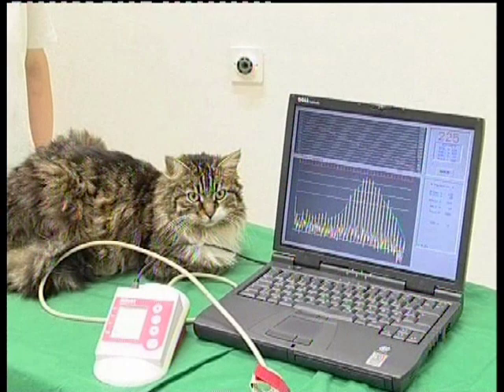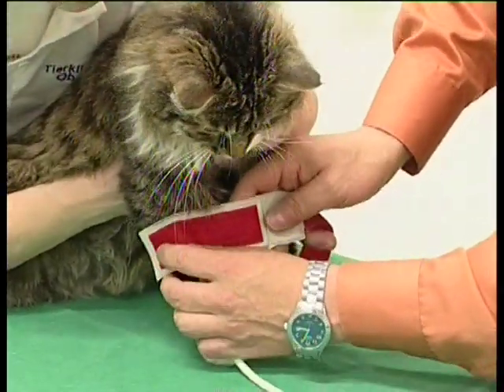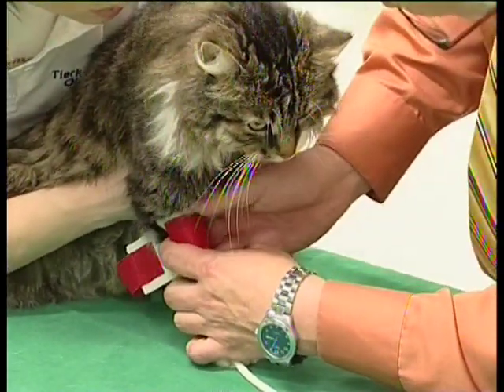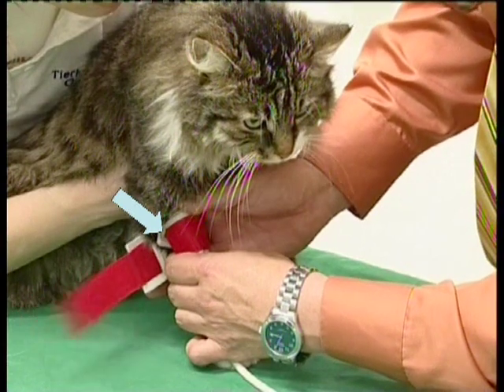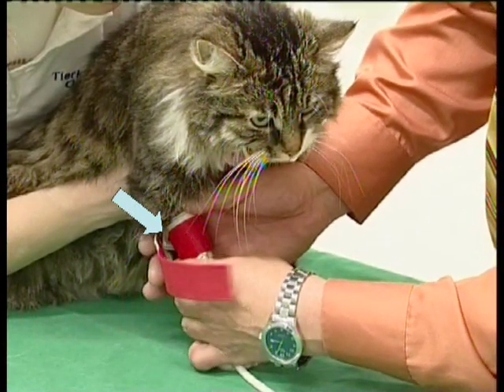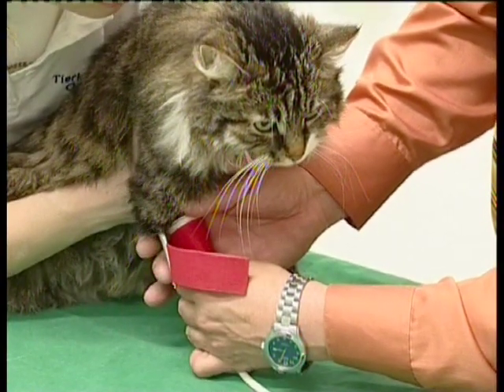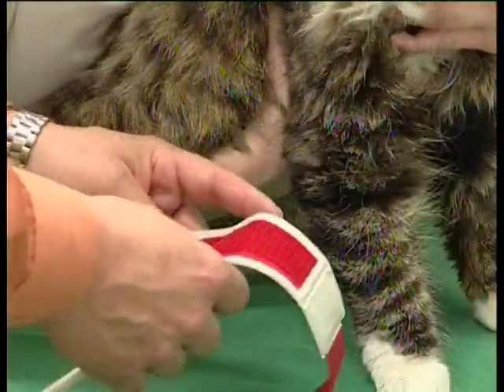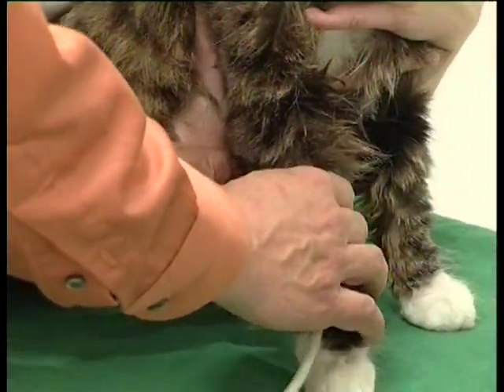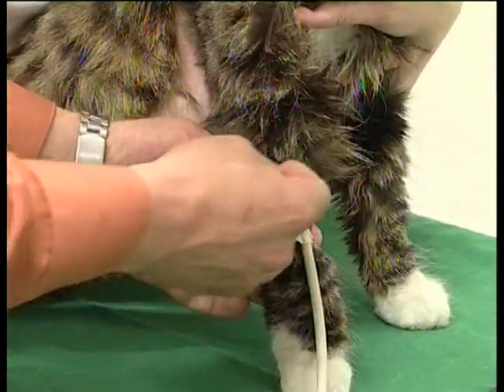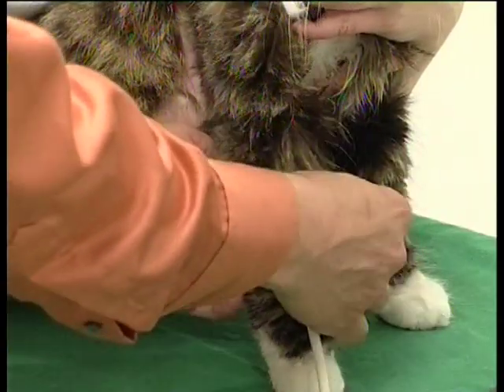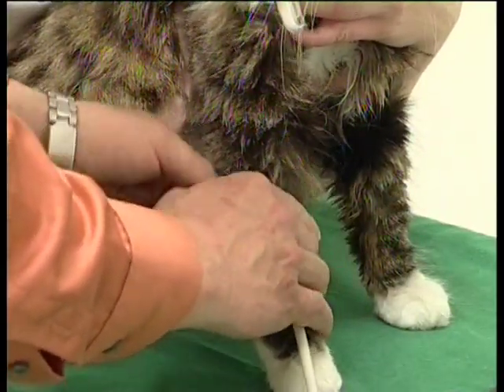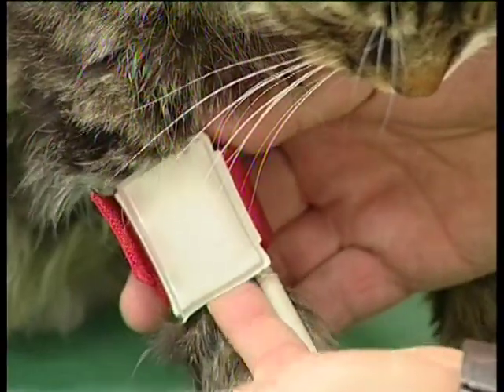Cats are as easy to measure as dogs are. Again, measurements can be taken from the front leg or the base of the tail. When applying the cuff, avoid producing a fold — a fold can cause an error message. Close the cuff tightly, but not too tightly. Do the small finger test: the little finger should fit just in between the cuff and the limb.